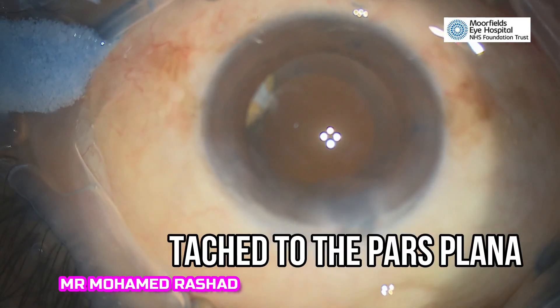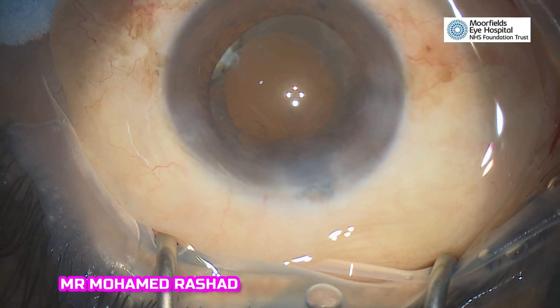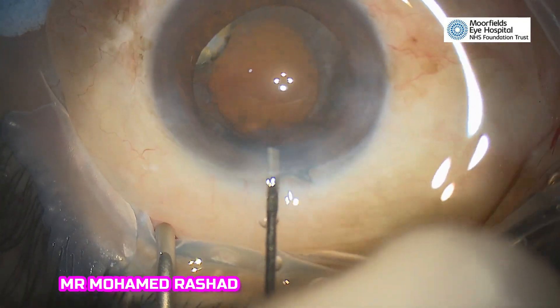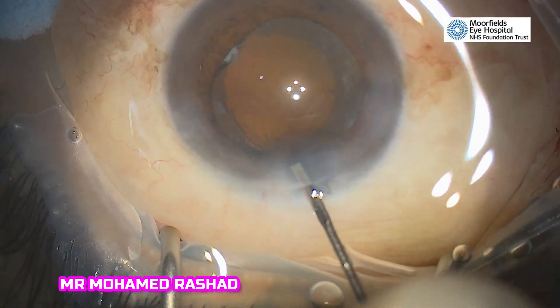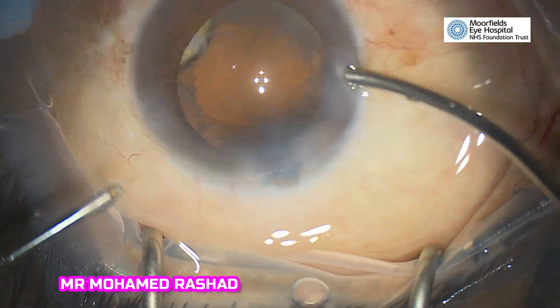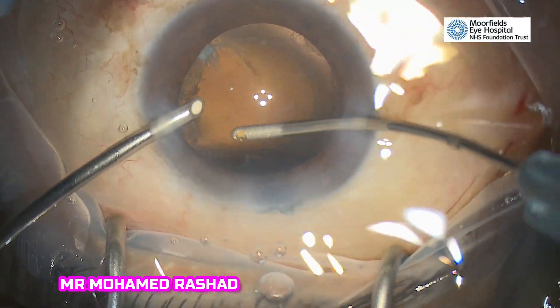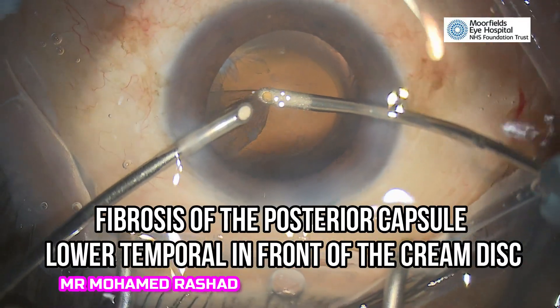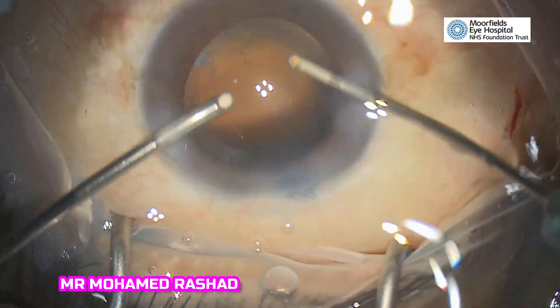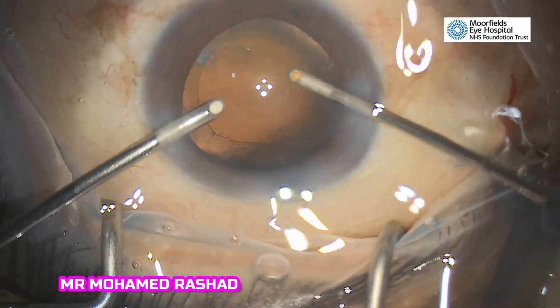By pressing on the pars plana you can find it moving. After hydro polishing of the capsule, you can confirm that this mass is attached to the pars plana — it's not moving freely in the vitreous cavity. There is some fibrosis over this area, lower temporally.